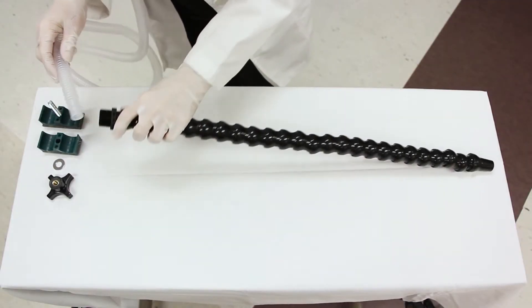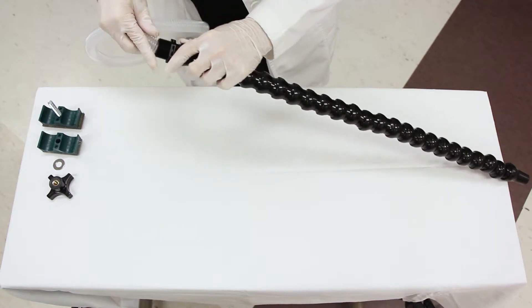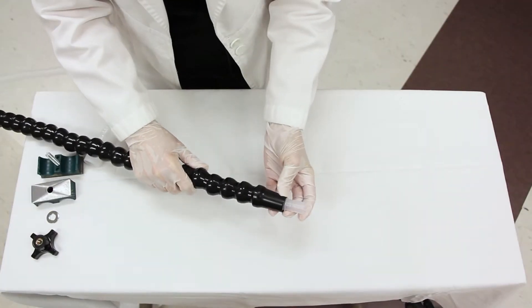Gently push the small tapered end of the breathing circuit through the clamp end of the flexible arm until it reaches half an inch beyond the opposing end.